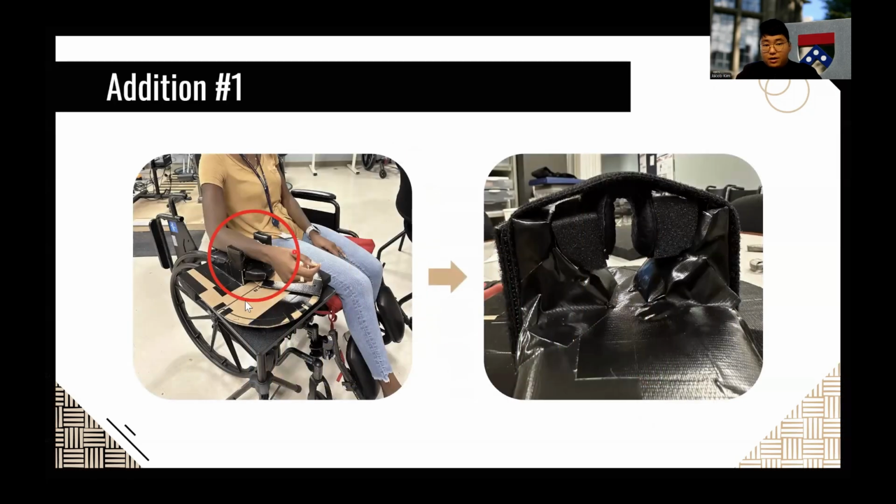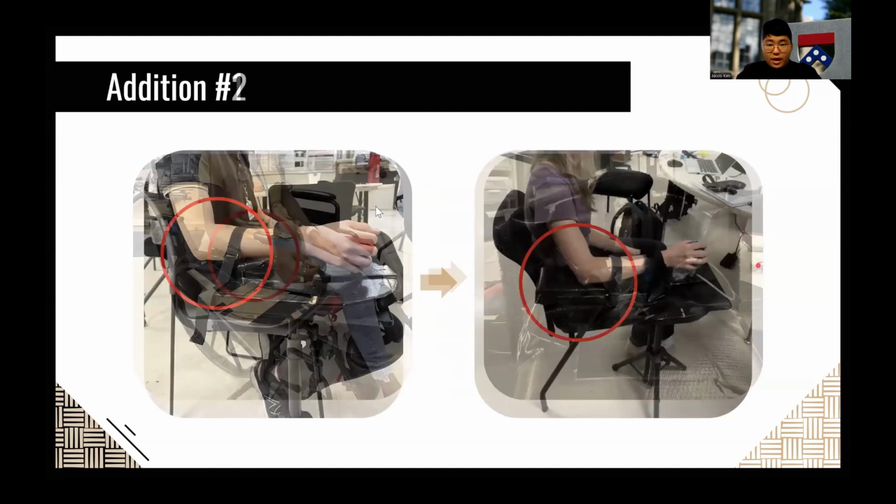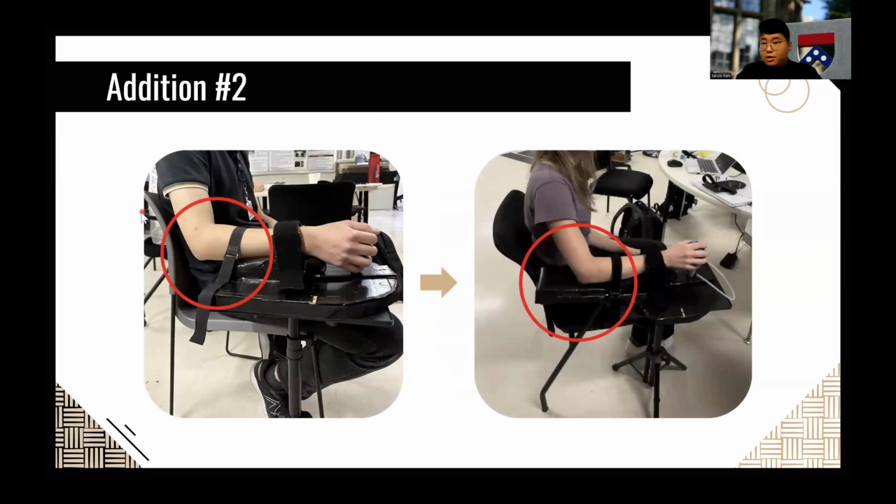First of all, to account for smaller wrist sizes and varying wrist sizes in general, we were able to make optional and detachable wrist padding. And to make sure that patients without much balance or arm control can rest on their device nicely, we decided to add this adjustable and extended elbow padding over here.